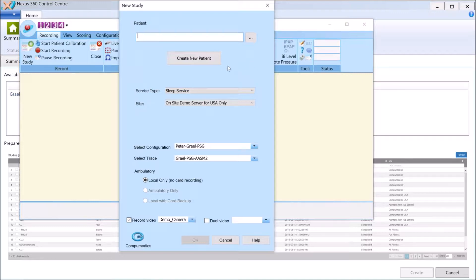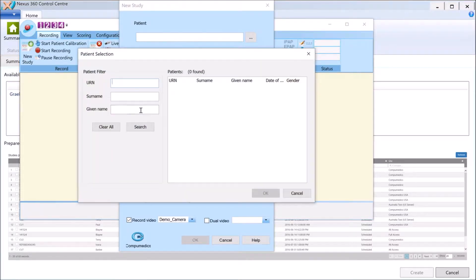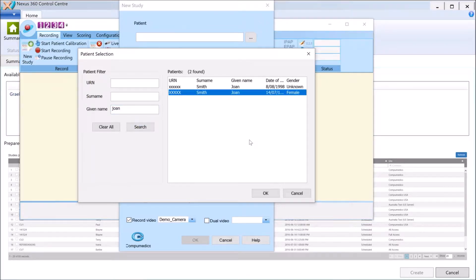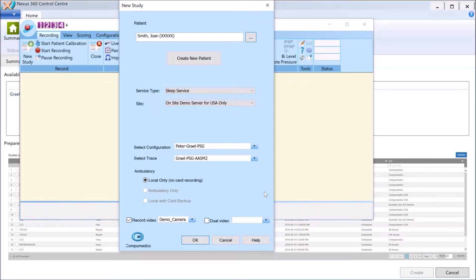This gives us the New Study dialogue page. You can create a new patient from here or use one that's already in the Nexus 360 database. I'm going to search — I've got a patient in the database already. I've actually got two records and I'm just going to choose the one that I want.